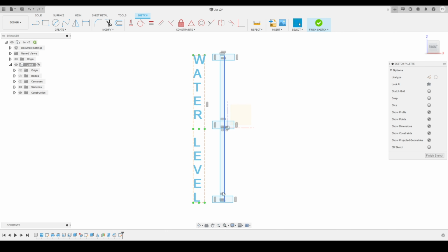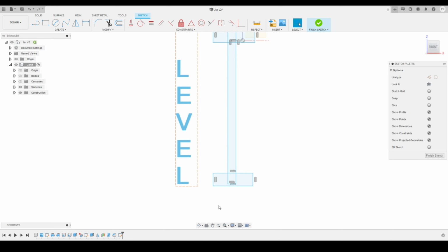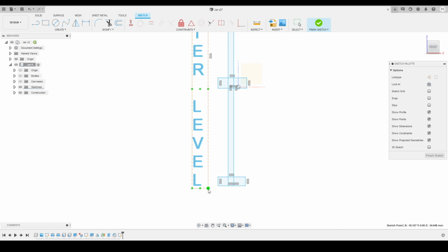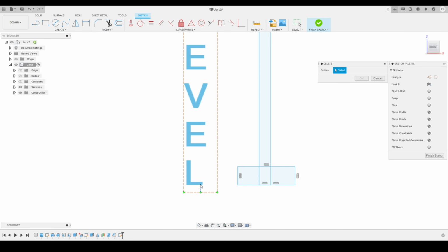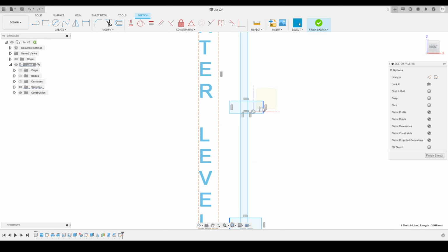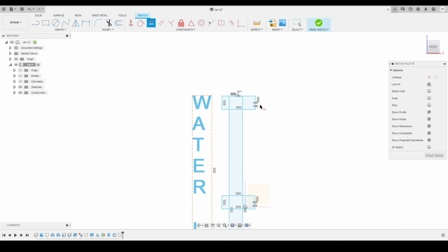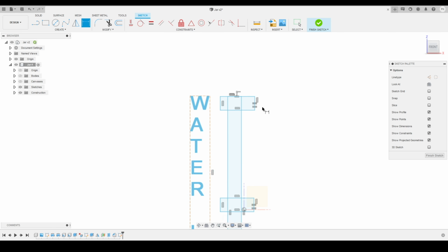So I had created three rectangles like this, and now I will apply a few more constraints. We'll make sure that these are all adjusted and look like a more uniform shape. So I'm just adjusting things. I will make sure that the text box is also in line with the labels that we are defining. So I will make sure that this bottom point over here matches with the text. Here you can see I'm trying to match it with the text, so we'll be able to match it with the label symbols I'm making. That's why we are doing this. So I will make sure that all these three sizes are equal. We had selected all the sizes and we'll apply the equal constraint, and then we'll define one of the dimensions to make sure that we got the right thickness.